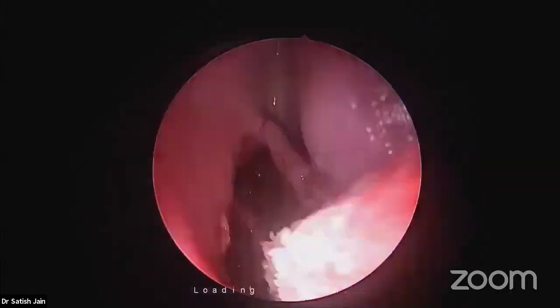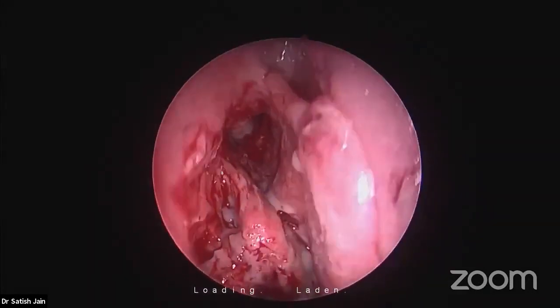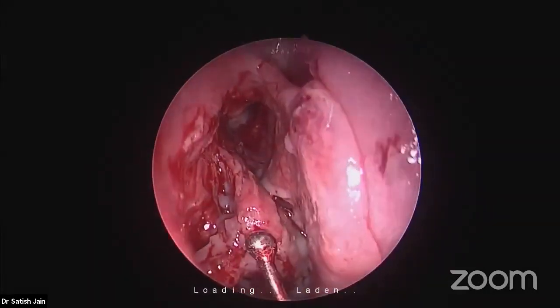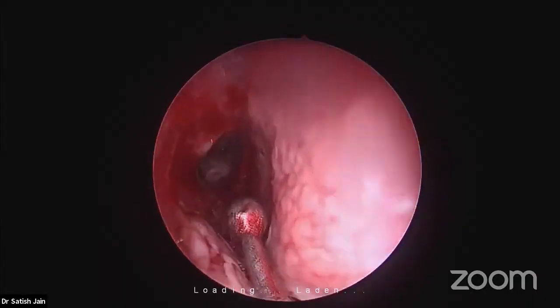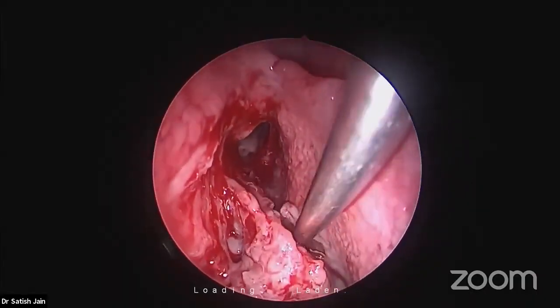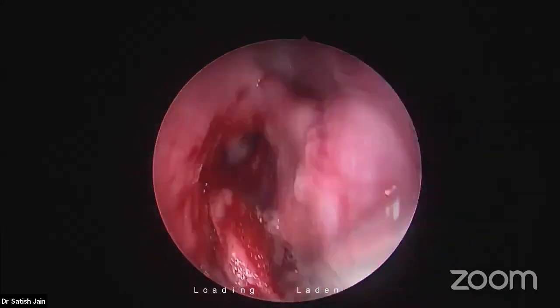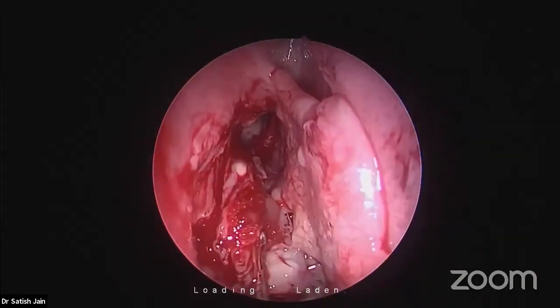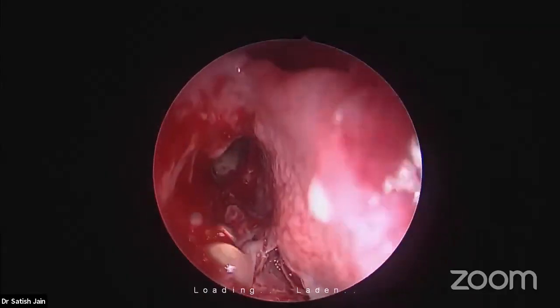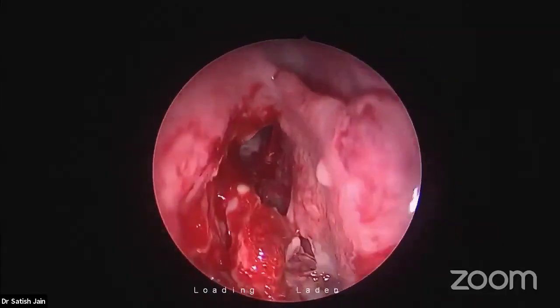Majority of the time, the bulla goes right up to the skull base. And behind the bulla is the anterior ethmoidal artery. If I fracture this bulla like this, you'll find the anterior ethmoidal artery protected by it. And that's a very good protection for the anterior ethmoidal artery.